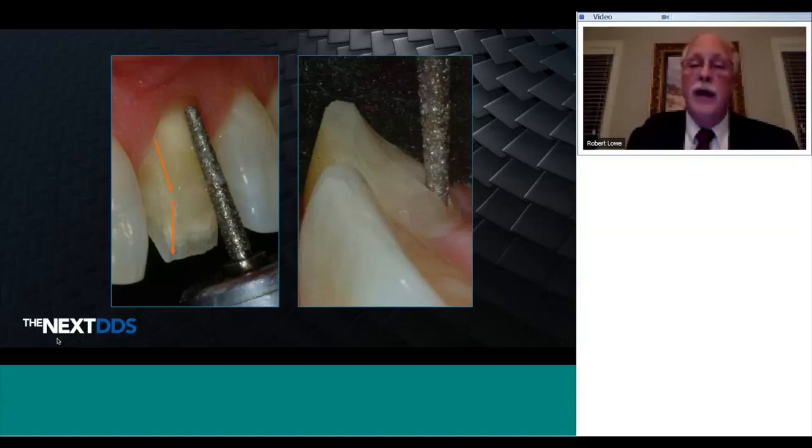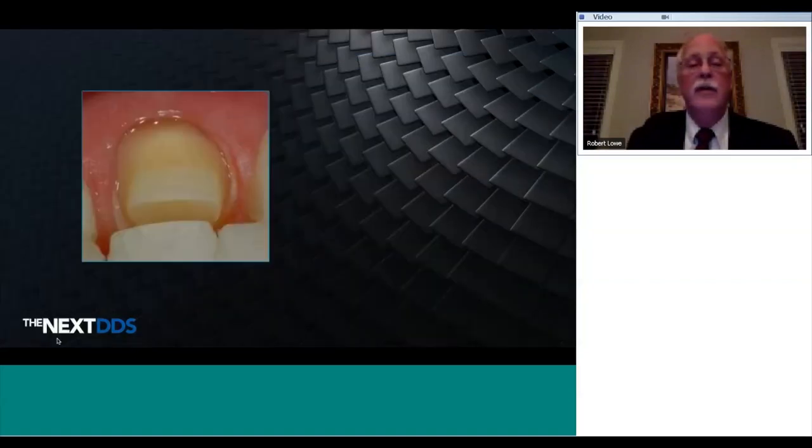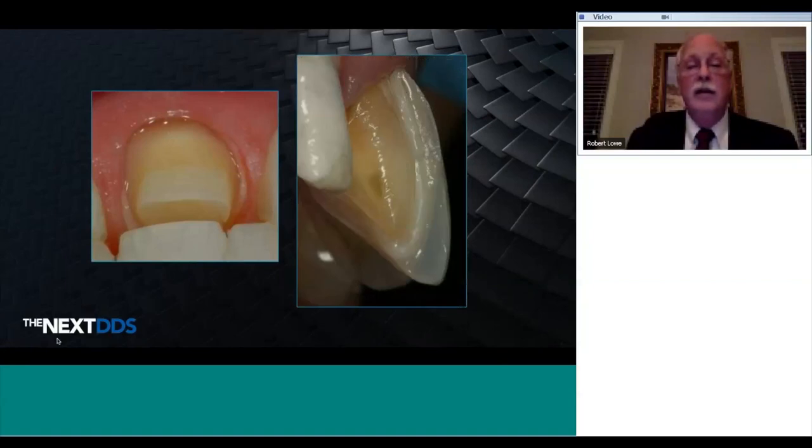Here's the palatal side of an upper central incisor, three distinct planes. This part of the tooth is often underprepared by the dentist. I'm preparing a depth cut here, and then I use an elliptical burr to create the concavity, which you see here, so that when you see a cross-section of the restoration, you see the natural anatomic form and uniform thickness of material in the stress-bearing areas. Here's the occlusal contact in this area, and a nice thickness of porcelain for aesthetics on the front.